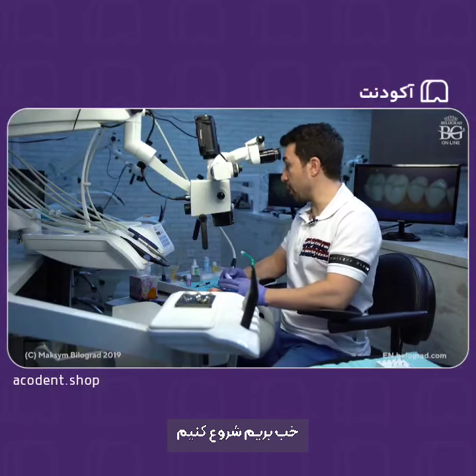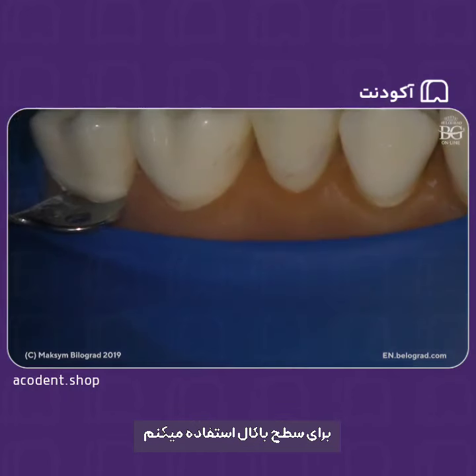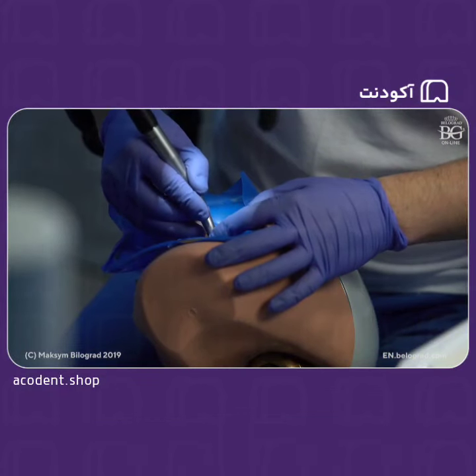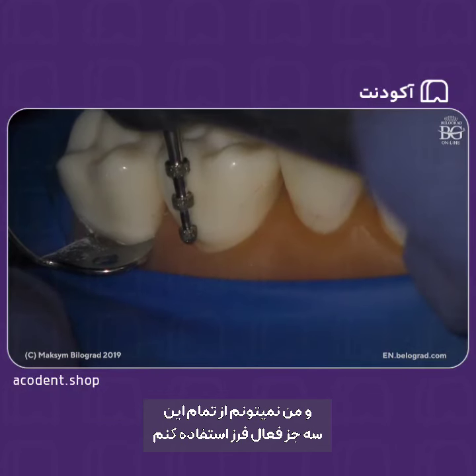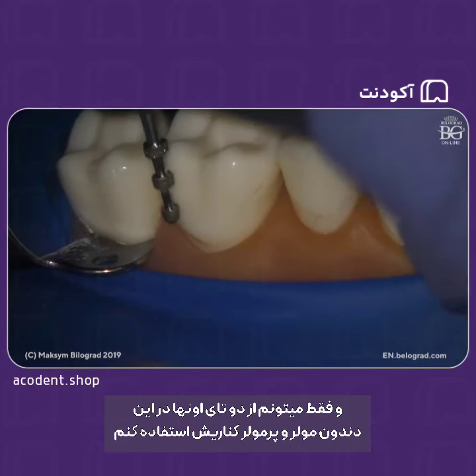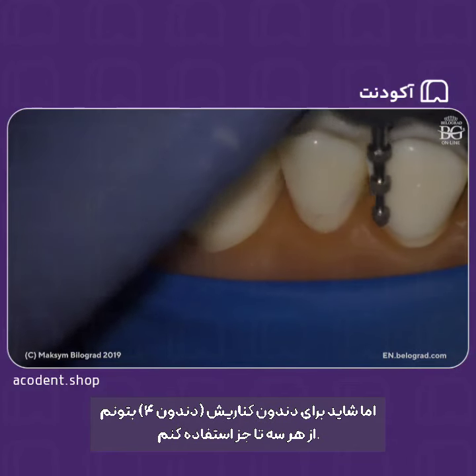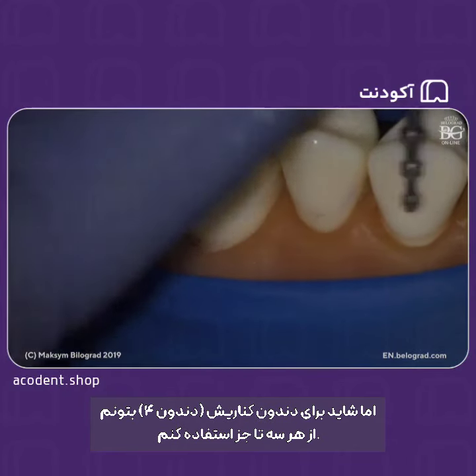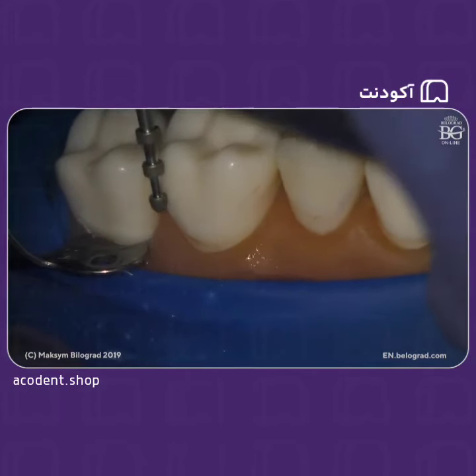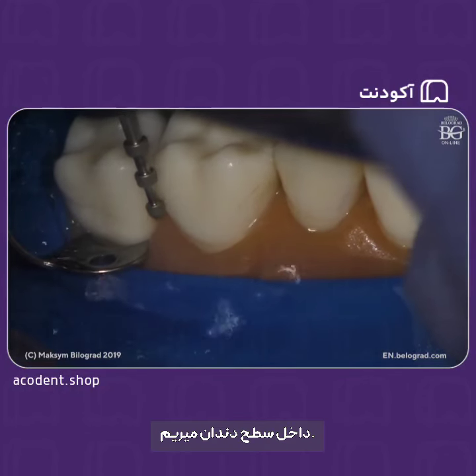Okay, so let me just start preparing. I'm using my depth cutter for the buccal surface. You see that the tooth is pretty short, so I cannot use these 3 active elements. We can use just 2 of them on the molar, and on this premolar also. Maybe for this premolar I'll be able to prep with 3 active elements. So let's go. A lot of water. You go within the surface.